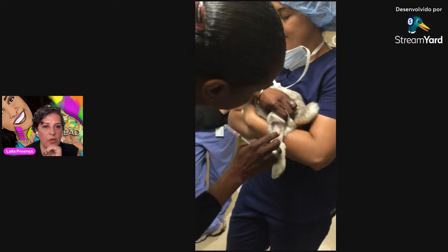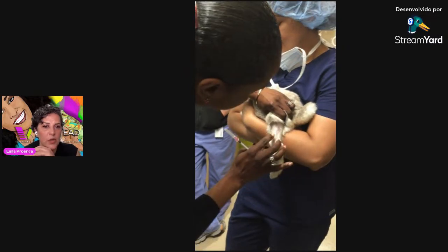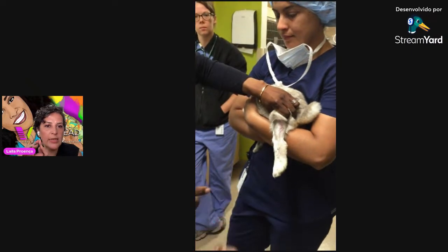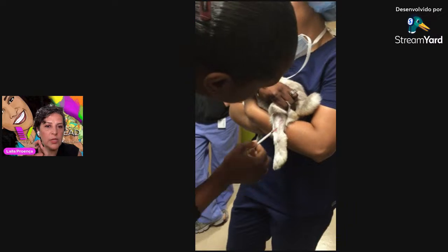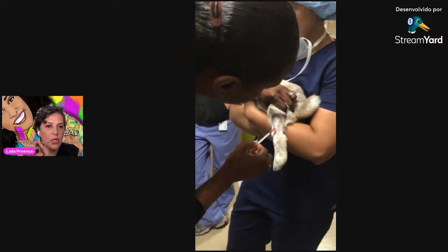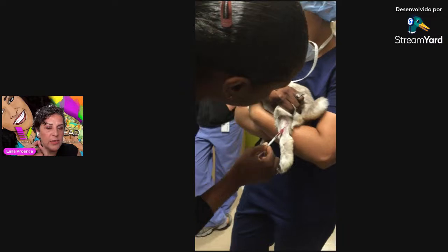Can you guys hear Coco? Literally, this is the first time this person is collecting blood. So we put alcohol on the leg, okay? And now she is holding the syringe, having identified the vein. With the left hand, she's holding off the vein and holding the leg of the animal. This animal is not sedated, and she's pulling the blood at the same time. See that she's holding the syringe.